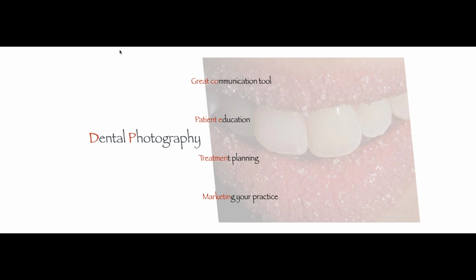The third reason why I think photography is important is treatment planning. In today's dental practice, we normally work in a very busy environment. I'm a very busy person because I have to share my practice time with my teaching time, and I have to put effort in both of these areas. So for me, dental photography is key, because it lets me have my patient's mouth, his face, the way he smiles, everything in my computer.